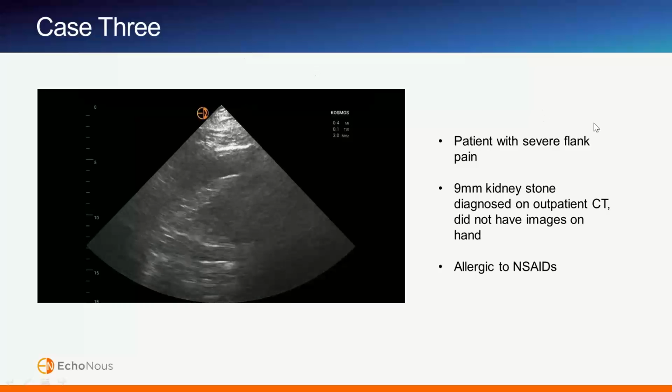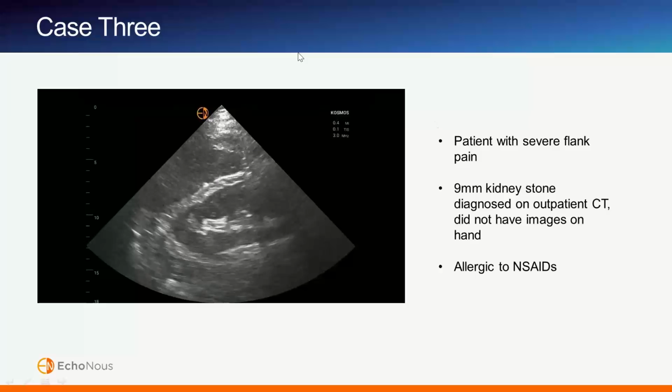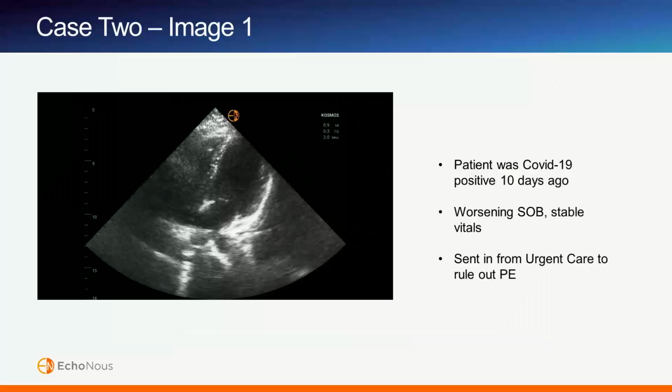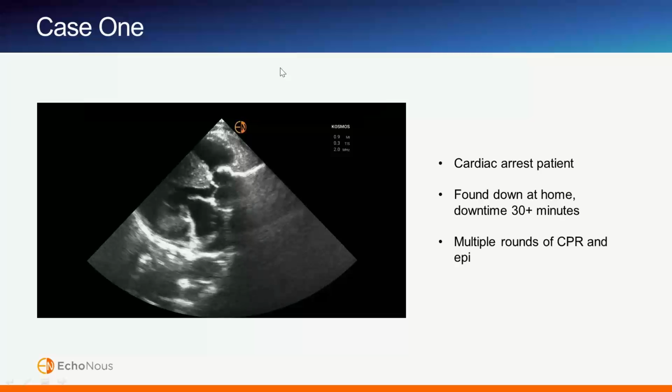And the other question that I think we can talk about a little bit more, it's a pretty big question. How should cardiac standstill affect your resuscitative efforts when you see that in a PEA arrest? Oh boy. I think that if a patient is in complete cardiac standstill and they've been down for a long time, that's enough for me to terminate resuscitative efforts. The clip that we have in the first image, where there was cardiac activity, there's a little bit more of a question here. But for me, if it's complete cardiac standstill and they've been down for a long period of time, that usually leads me to terminate resuscitative efforts. So I don't know what you think about that, Adaira.